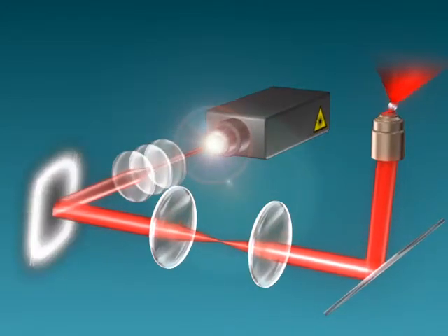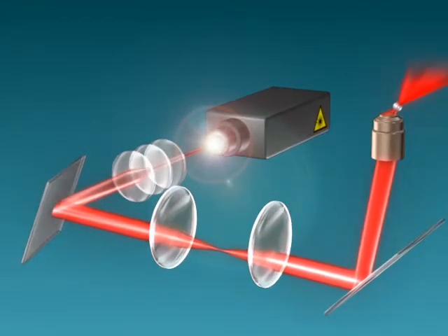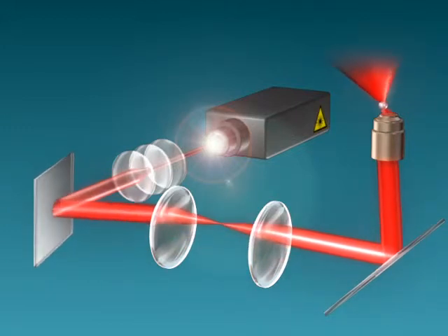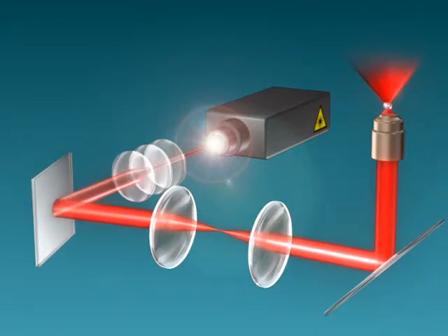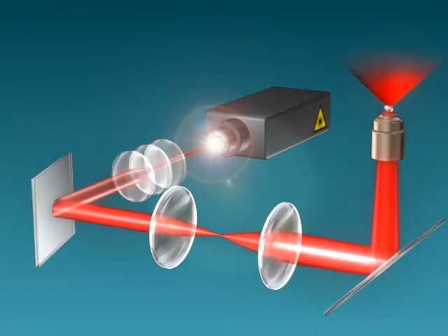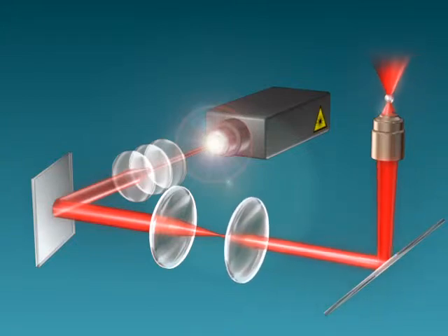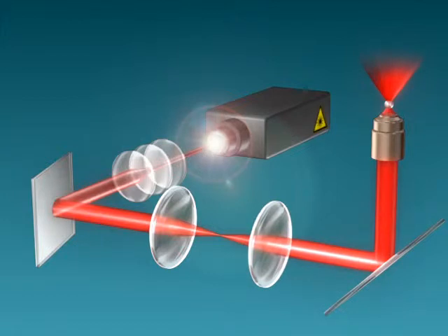By rotating the optical trapping mirror, the optical trap can be steered right and left in the sample plane. By moving the second telescoping lens, the optical trap can be lowered and raised. The trapped object follows the motion of the optical trap.